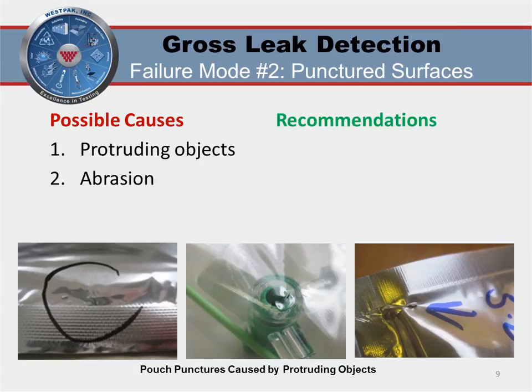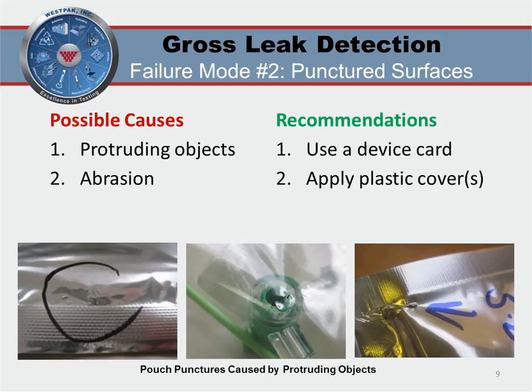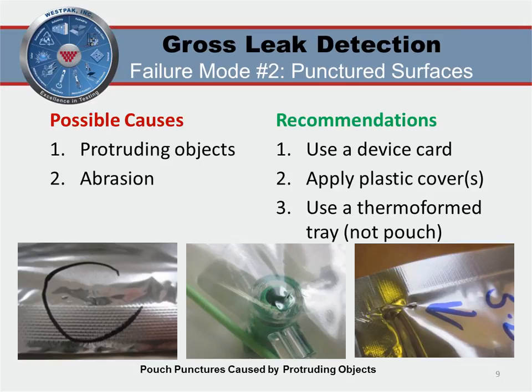Our recommendations would be to use a device card, such as a chipboard card with tabs. This would help hold your unit in place and restrict it from shifting too much. Try applying plastic covers over protruding objects, or maybe even switch to a thermoform tray if your product has a lot of protruding or sharp parts.